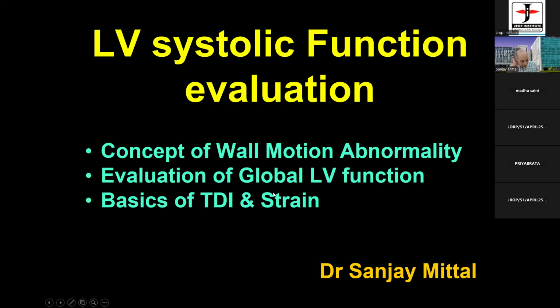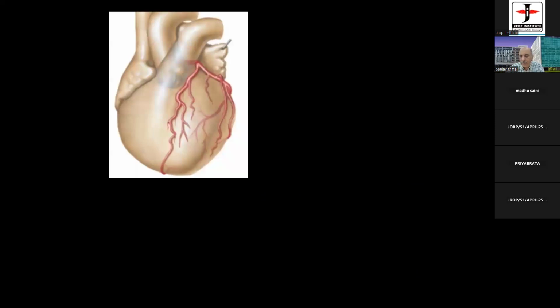Nevertheless, I am going to talk to you about the left ventricular systolic function assessment, focused on the wall motion abnormality assessment. Mainly, systolic function is assessed in a regional or global fashion. The reason is that the commonest cause of heart weakness is coronary artery disease.